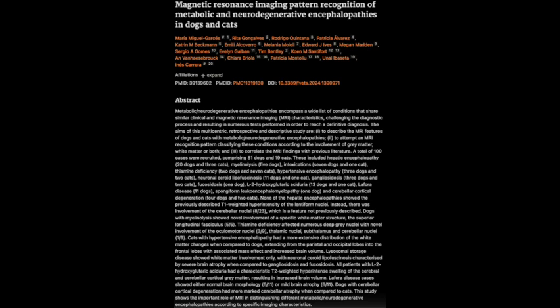Okay, but you did say earlier that cats can be different. Oh, yeah. Cats are always different. Why? They like to keep us on our toes. So with this one, how are cats different? Well, in cats, the MRI findings can be much more variable. Okay. They can have lesions in the white matter, like we saw in the dog, but they can also have lesions predominantly in the gray matter. Which is the opposite of what we usually see. Yeah, it's kind of the opposite. Wow. Okay, so cats, once again, throwing us a curveball.